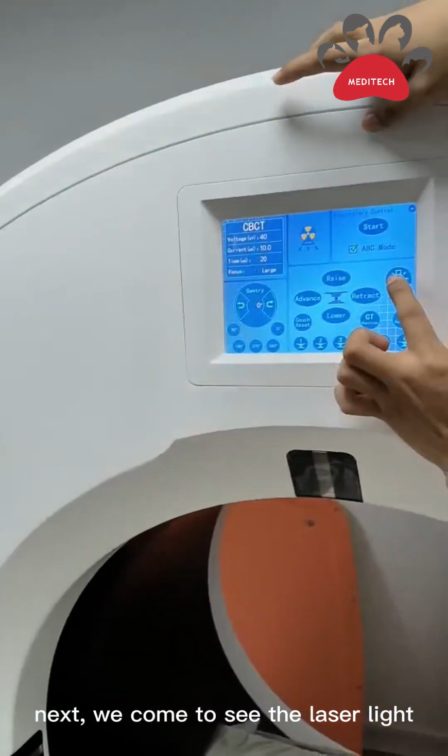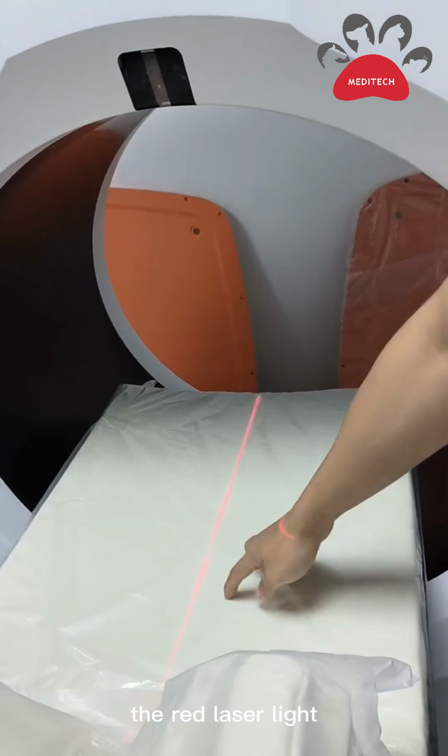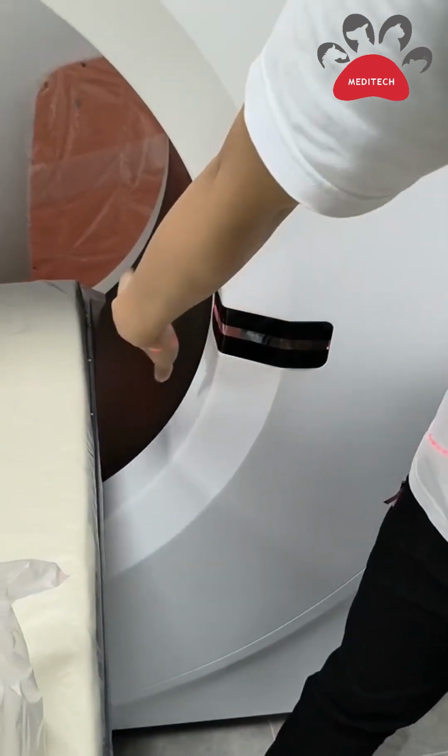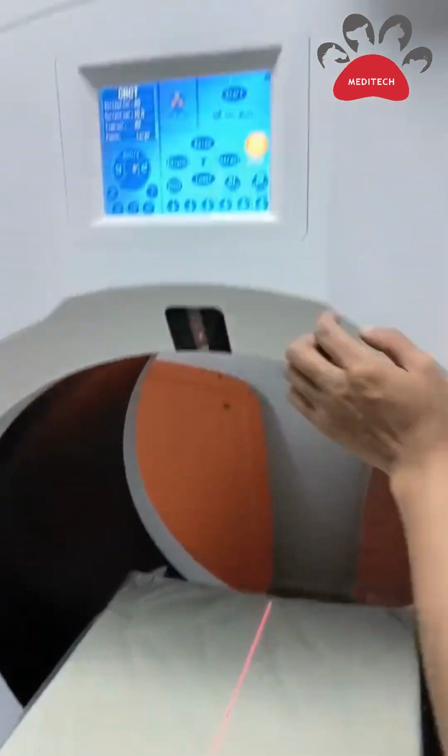Next, we come to see the laser light. The red laser light, and we can also see it on those two sides. One horizontal and one vertical, like a cross.